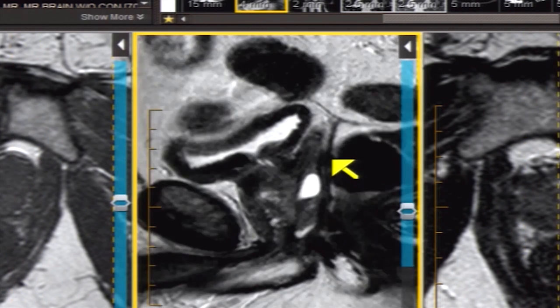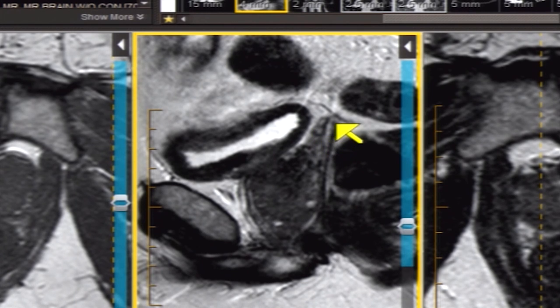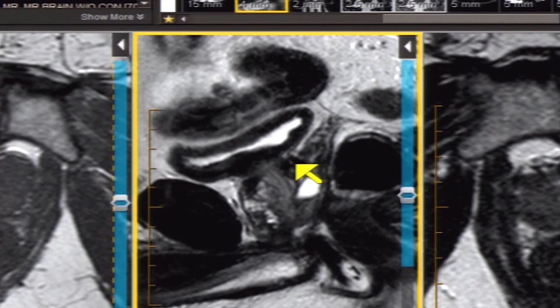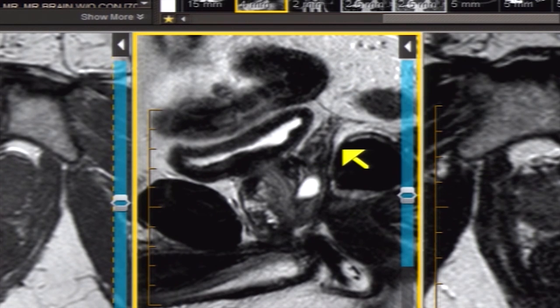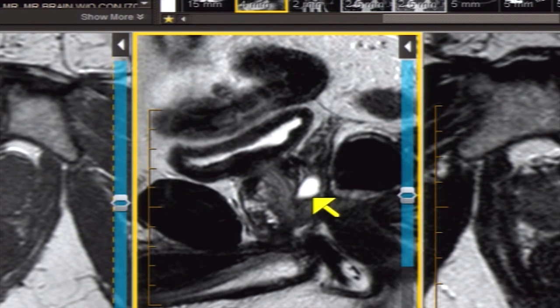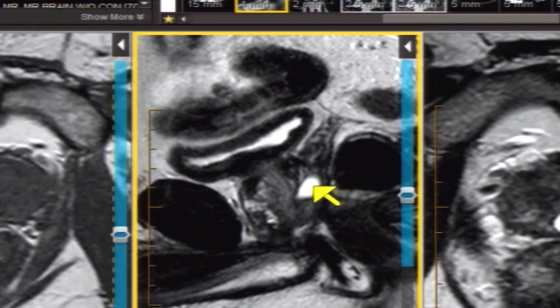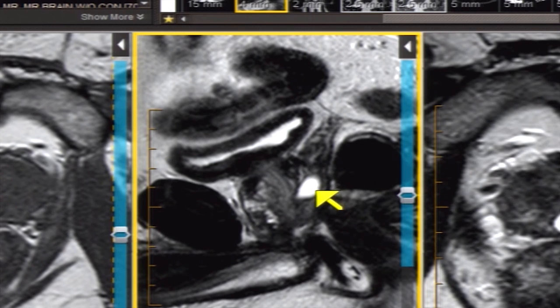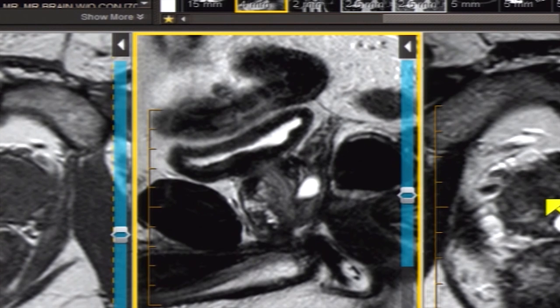Even on T2-weighted images, in older patients the seminal vesicles are not as bright as in younger patients and sometimes not bright at all. Unfortunately, when cancer infiltrates the seminal vesicles it also has intermediate signal intensity, similar to age-related desiccation. The bright signal intensity nodule seen here is a prostatic utricular cyst — in no way related to cancer. Most prostate cancers are intermediate or dark in signal, not bright like this smooth round midline lesion. That is a pitfall — the actual cancer is right next to it.